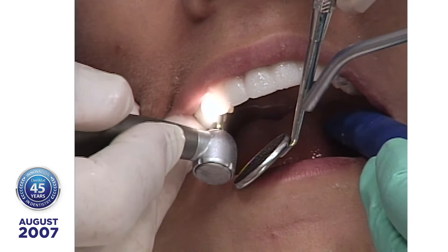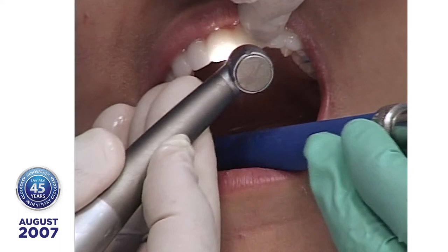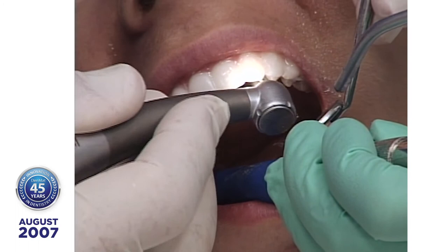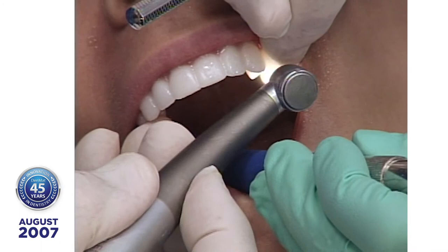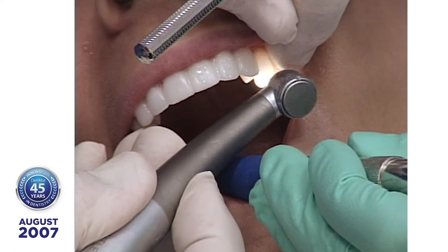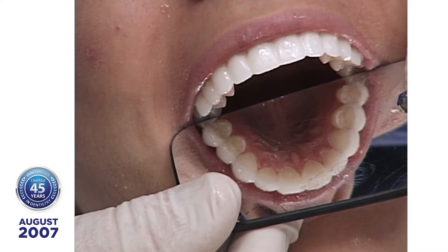I'm going around removing set ultrabond and porcelain, then I come over to the lingual side on the left. I use four-power magnification and start drilling on the porcelain with a medium-grit diamond and a lot of water spray — you never want to build up heat. You can see when you get to the ultrabond and just gently shave it away. Now we've pretty much blended everything together, with just a little bit remaining in the interproximals. Now we'll go to work on the labial with the 12-fluted burr on the interproximal embrasures.